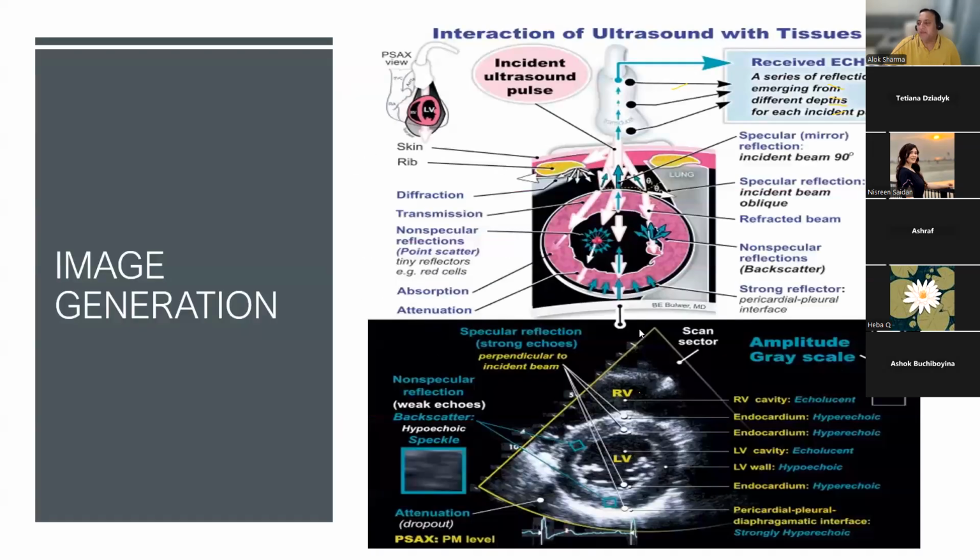A very good example of this is the heart. You can see a probe basically entering here. Now, in an ideal world, this probe just generates sound waves which go and impact on tissue, and they should come back. The shortest path that this sound wave takes at this particular point is this path. So naturally, an incident sound wave taking the shortest distance, hitting the epicardium of the heart, the epicardial wall, will interact with it and reflect back, and it will reflect back without losing energy.